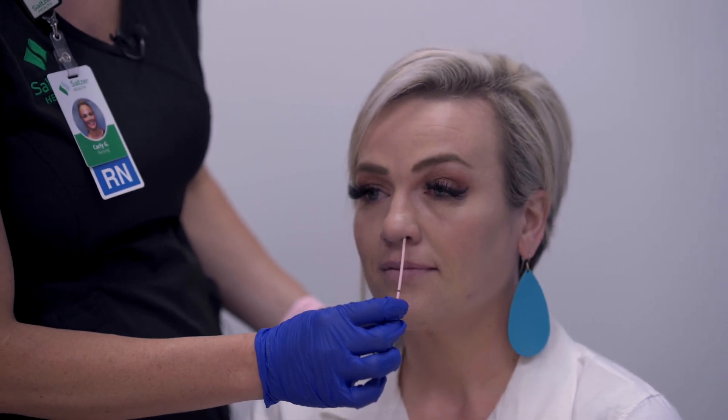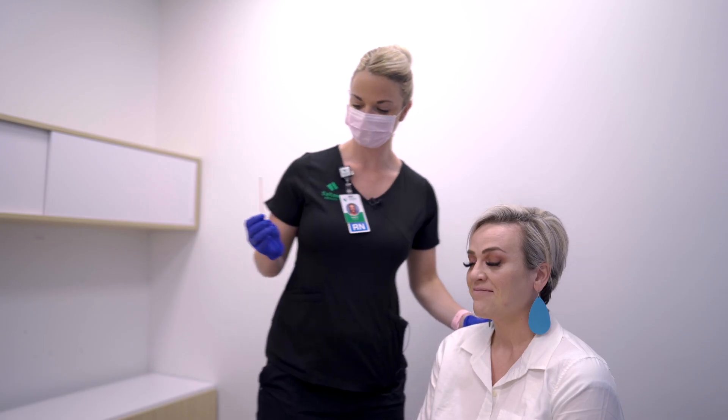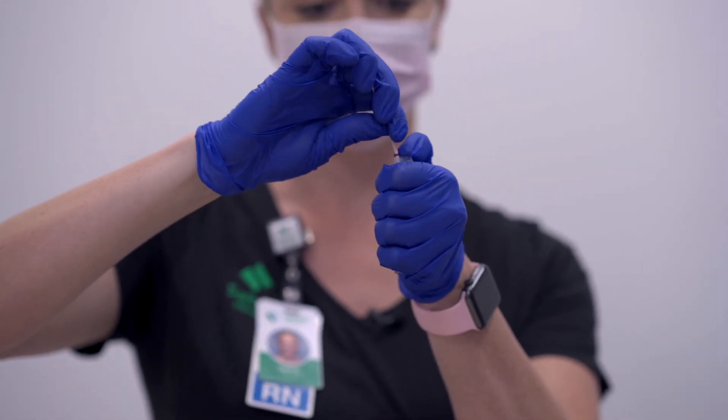It can make their eyes water, as you can see. Go ahead and remove the swab. Then you're going to insert the swab into the tube and break right at that black line.